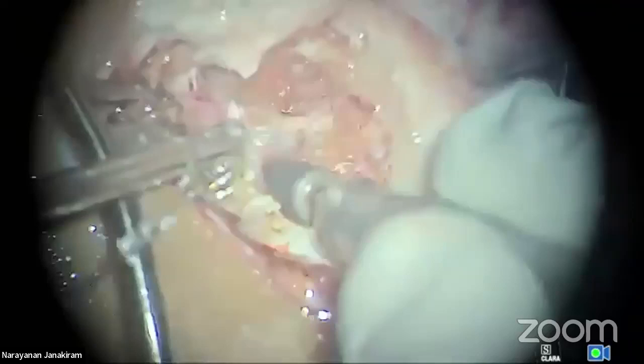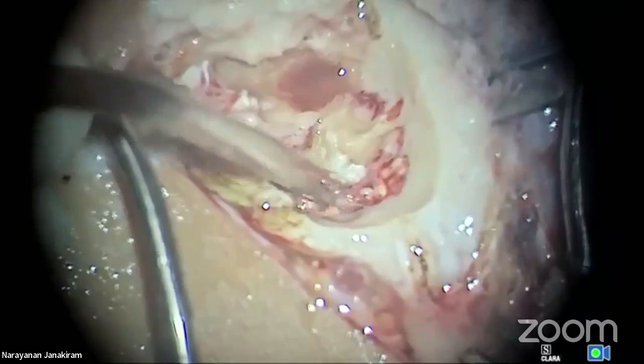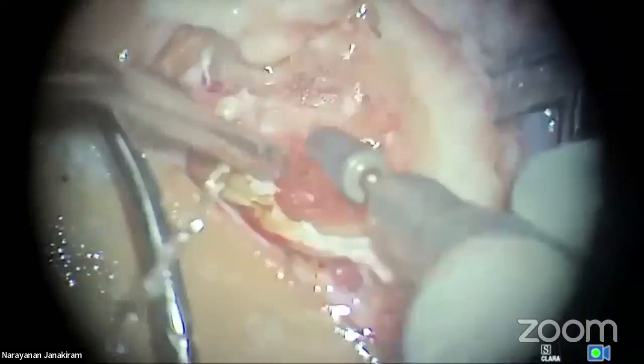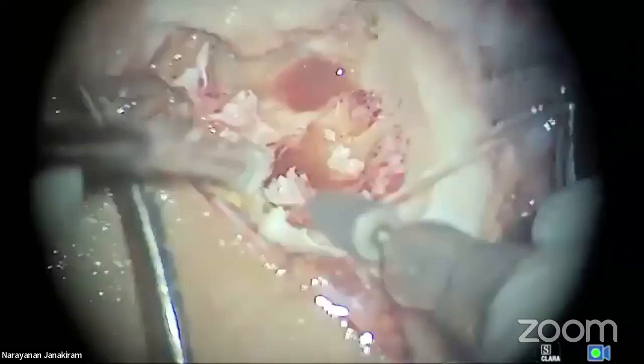See, don't go and jump onto the cholesteatoma again and again. I tell the same thing. See the edge of the cholesteatoma, what do you find? Granulation. And always make an obtuse cavity, not an acute cavity. You understand? Yes or no? You have to go till the edge of the cholesteatoma.